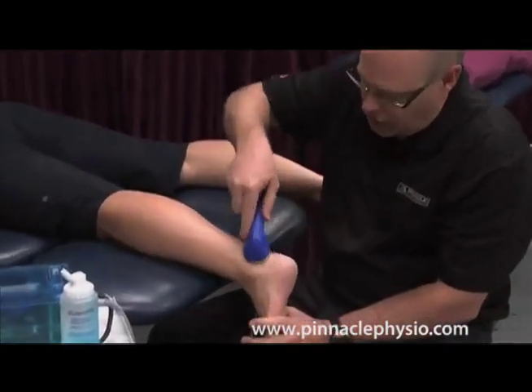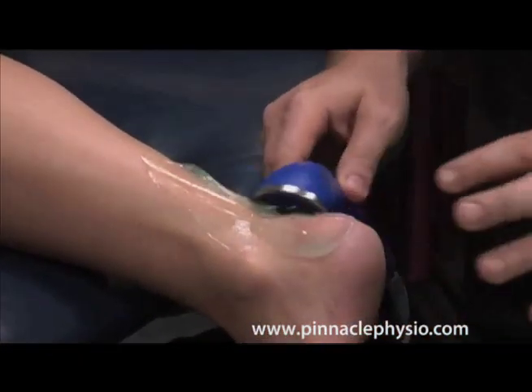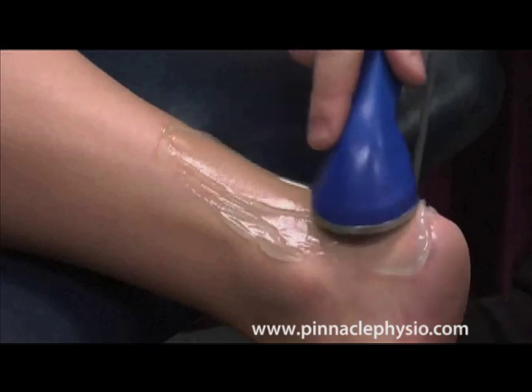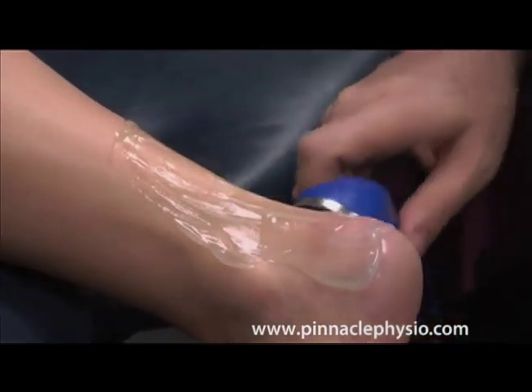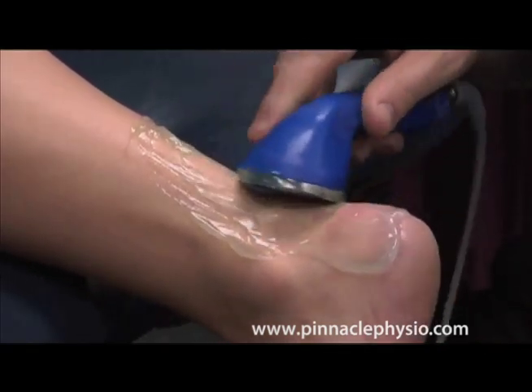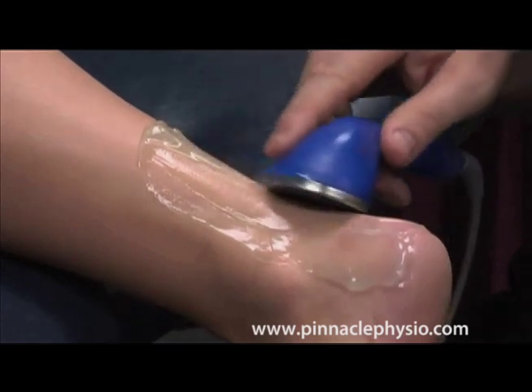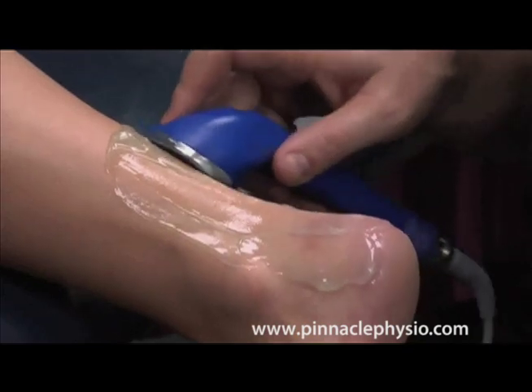The machine emits sound waves that go through the gel, through the skin, and into the tendon. In this case I'm using the ultrasound waves to increase cell activity in the tendon — that vibration you saw in the demonstration goes into the tendon, increasing cell activity and speeding up the healing process. This has been shown to cut healing time of a bruise by almost 40%, using sound waves to break up the bruising and get cells functioning faster.